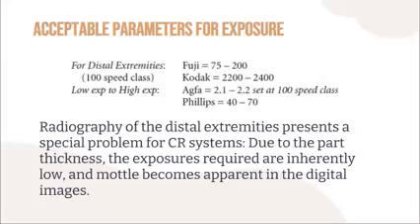So the lower the speed class, the less sensitive it becomes to radiation, meaning more technique, and when there is more technique, the patient dose is higher, but the quality of the image is much better than those of the higher speed class. So the speed is lowered for extremities because, again, with lower speed, the technique used is higher, which means higher kVp.